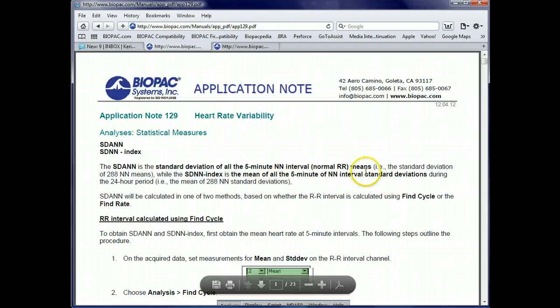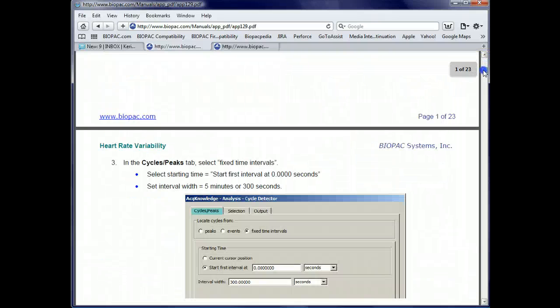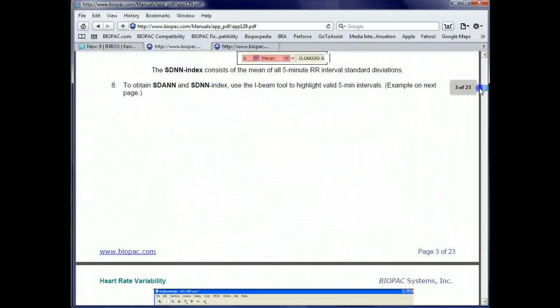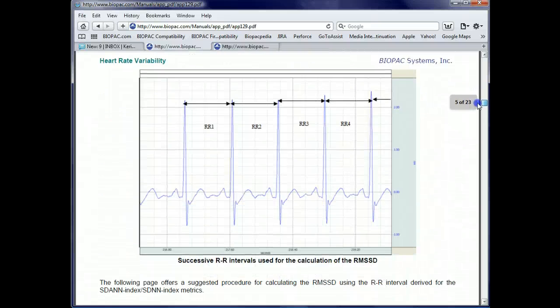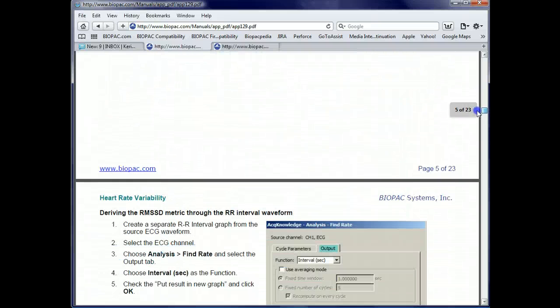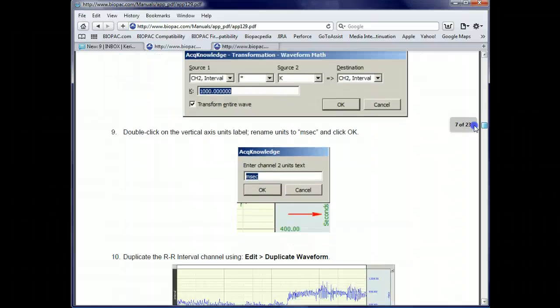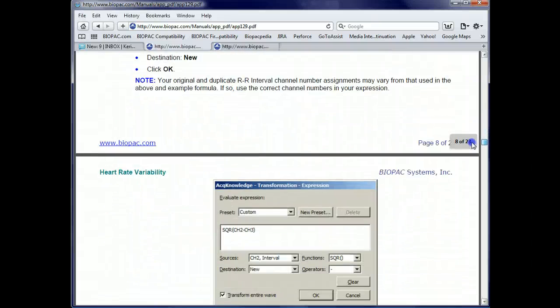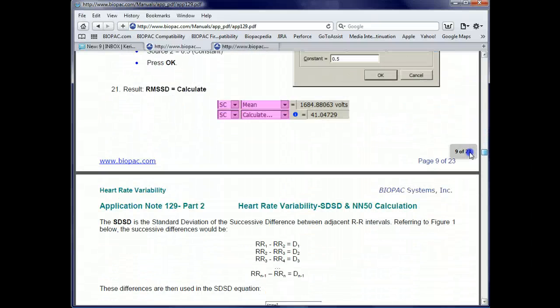The specific statistics that are computed by this script are the RMSSD, the SDSD, and the NN50.